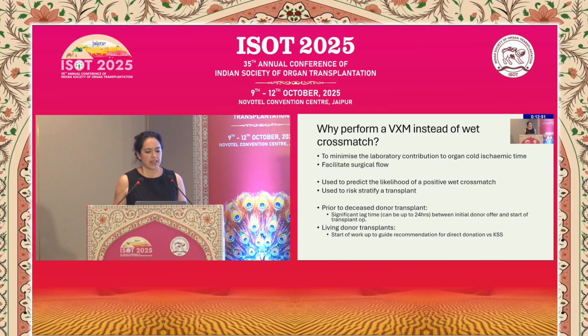And I'm going to focus again on the virtual cross-matches that we perform in a deceased donor setting, although we do also use it at the start of transplant workup for live donor pairs to guide recommendations for whether they go for direct or via the kidney sharing scheme.